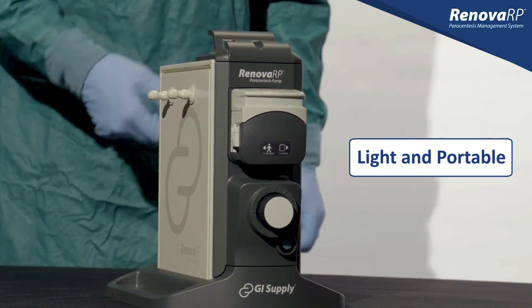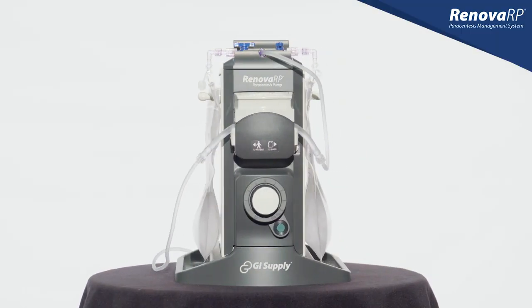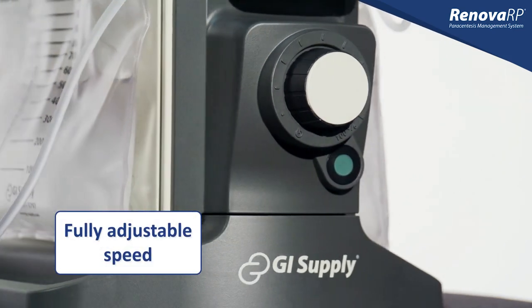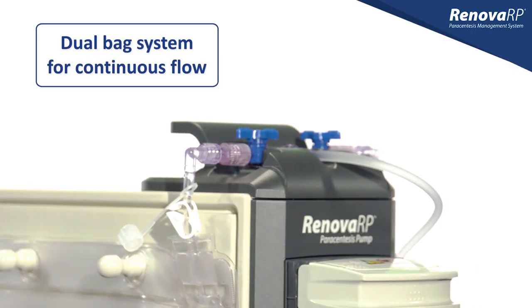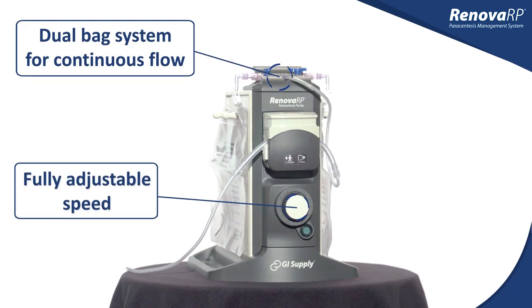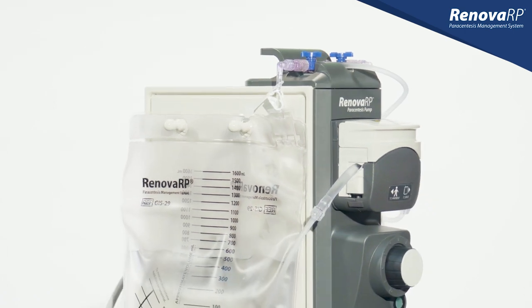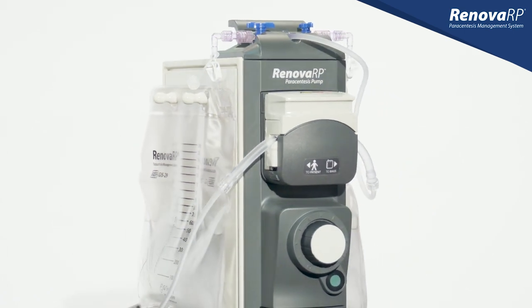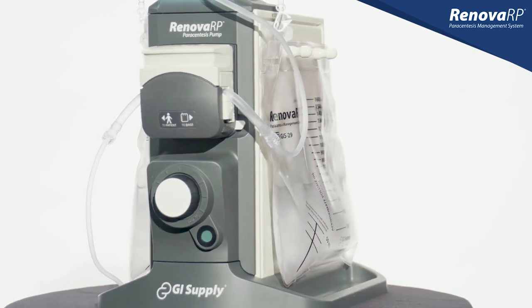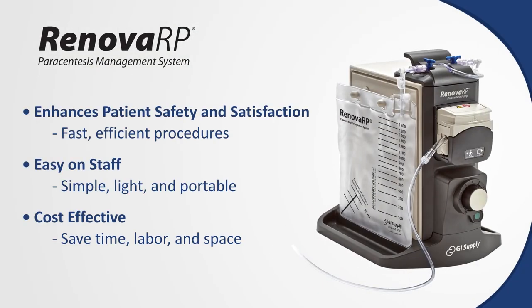GI Supply's Renova RP Paracentesis Pump is the modern alternative to traditional vacuum bottles. This simple, portable pump offers fast and efficient procedures while enhancing patient and staff satisfaction. Using bags that store flat, the Renova RP system saves valuable storage space as compared to bulky bottles. In this video, we will demonstrate the simple setup and use of the Renova RP Paracentesis Pump as compared to plastic vacuum bottles. You'll quickly see how the Renova RP can improve the overall paracentesis experience for both you and your patients.